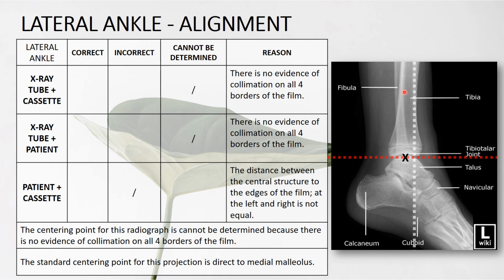The centering point for this radiograph cannot be determined because there is no evidence of collimation on all four borders of the film. The standard centering point for this projection is directed at the medial malleolus, which is here.